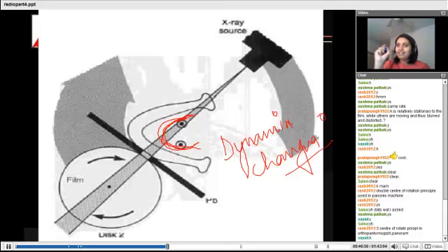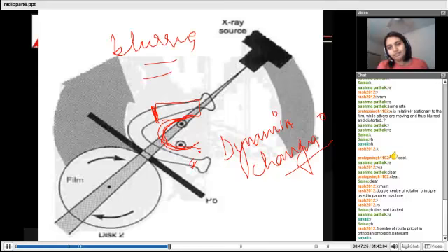Okay, understanding the thing, the more centers of rotation, the more proper orientation you will get for every point. Now, why were we seeing that blurring? It was relative, because as soon as we changed the center of rotation, this particular zone was nicely focused. Now, if you have a continuous change of the center of rotation, although there may be slight blurring of the adjacent structure, it will be done so uniformly that your eyes will not notice that blurring. Getting the point?